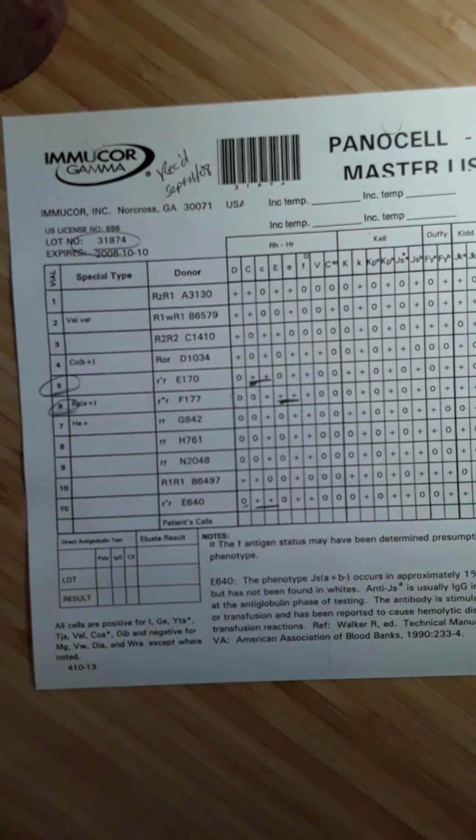And what I mean by that is I'm going to take 2 test tubes, label them panel 5, panel 6, and my patient's accession number. 2 drops of patient's plasma, 1 drop of cell 5 into one tube, 1 drop of cell 6 into the other, 2 drops of PEG, and into the incubator and taken through the IAT procedure. If these tubes do not react, then I have my second slash for big C and big E.